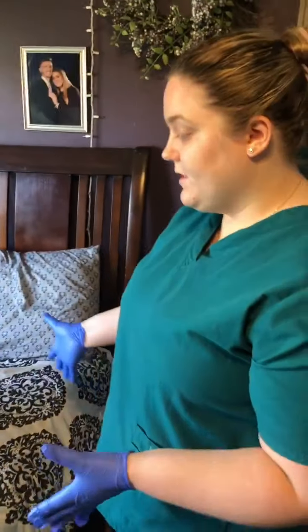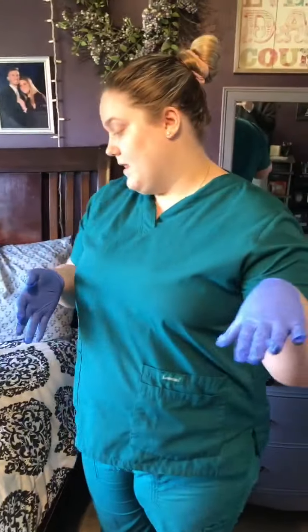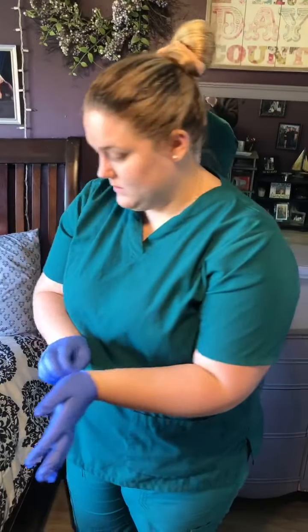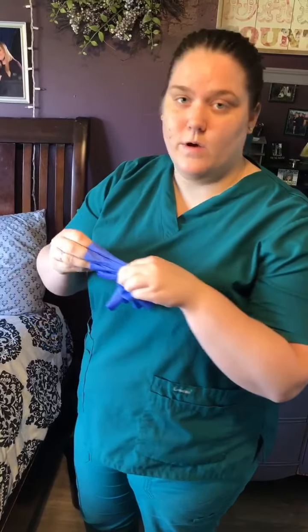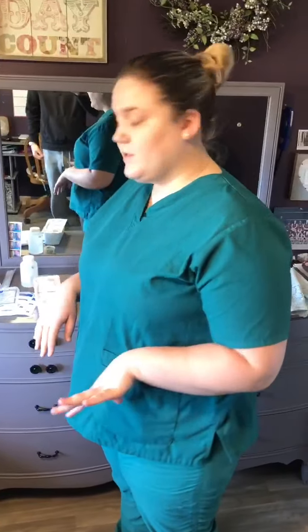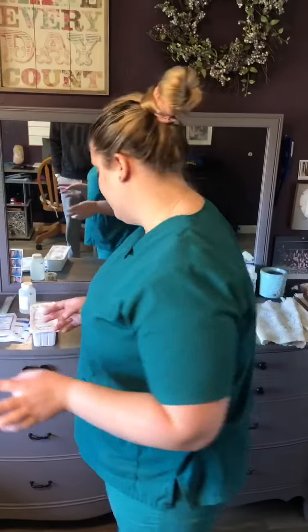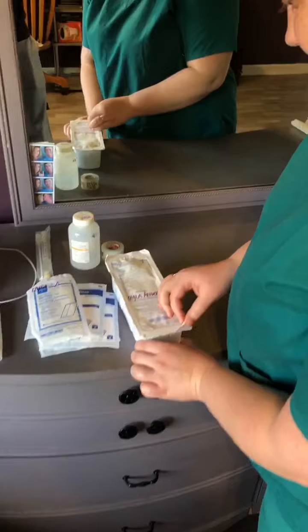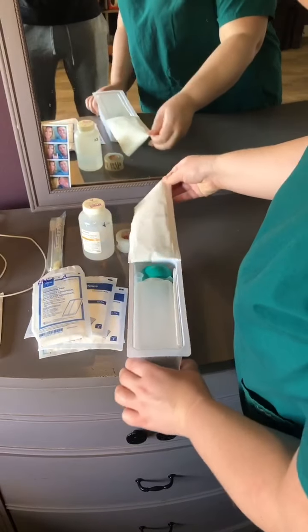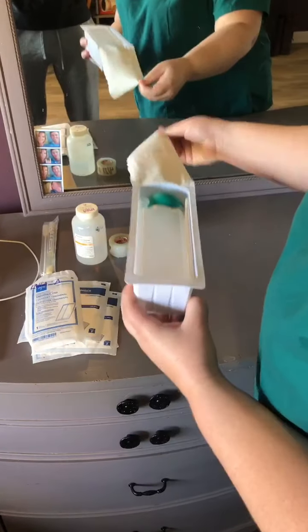So that's all measured. I will note all of that, and then I'm going to get set up for my sterile procedure. I'm going to take off my gloves and then wash my hands. So after I removed my gloves, I'm going to set up my sterile field. So my drape is inside of here, so I'm going to be careful not to touch the inside.